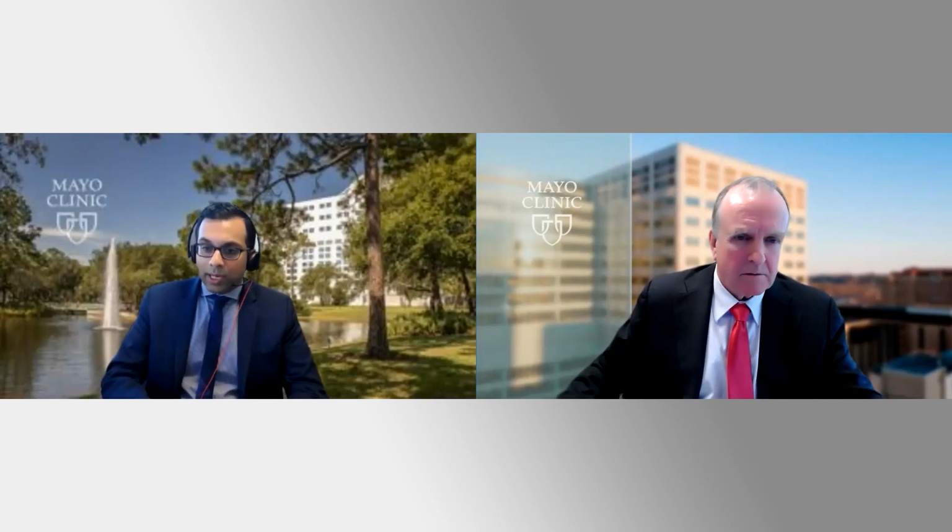Yeah, absolutely. So I would choose cardiac MRI over CT. If I have the CT data, I'll certainly look at it, but I think MRI just gives you a lot more information in terms of chronicity, active inflammation. There's ways that we characterize it. I'd describe it akin to how we look at the myocardium, where the CT can see everything from the heart perspective, but it just doesn't have the tissue characterization that the MRI would offer.